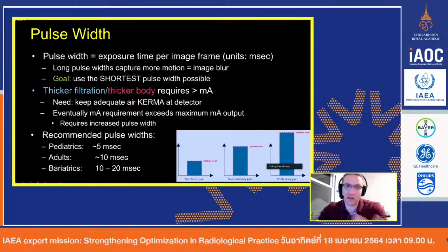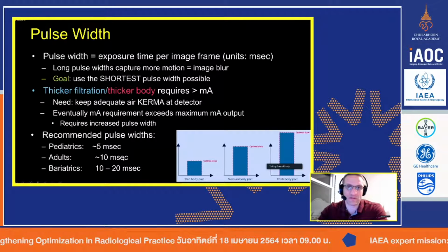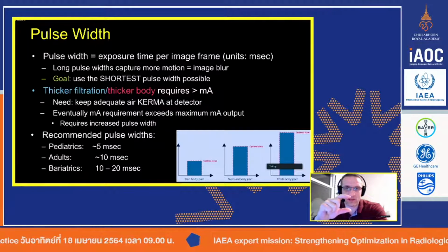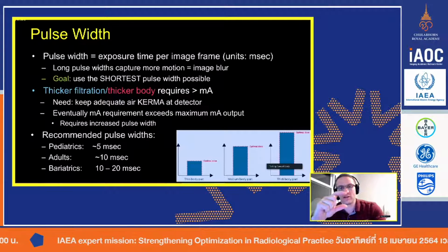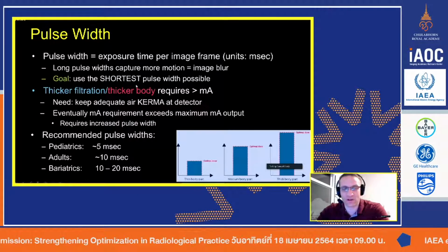If you go in and measure this for all of your different systems, I'll bet you right now, every one of your systems is different. So you take the same, for example, block of plastic. Let's say you take 15, 20 inches or centimeters of plastic. You put it in your X-ray tube between the tube and the detector, and you image it, and you put your solid state detector in there, and it'll measure the waveform.